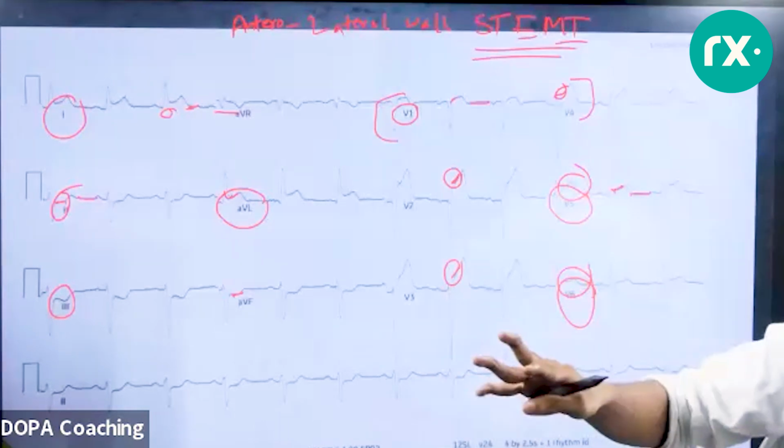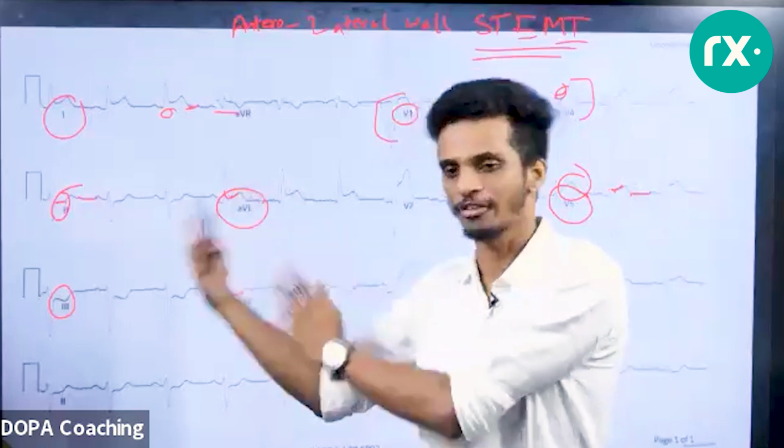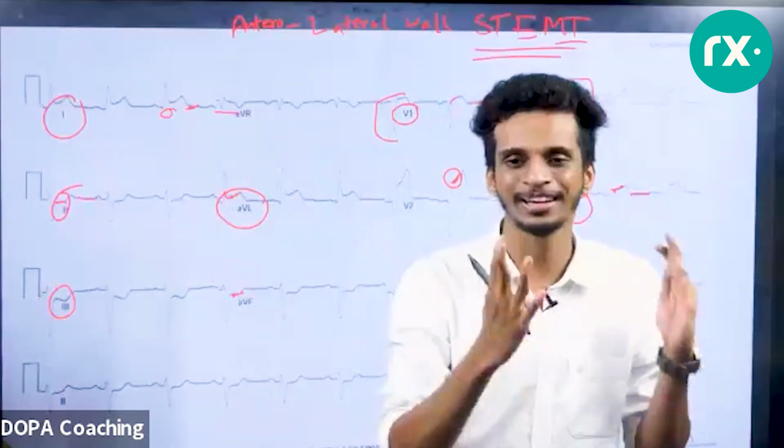I'll discuss, I'll take it out. So what about aVR lead? aVR lead, if I start discussing about aVR lead, it's a whole different topic. Okay, so for the time being, I'll restrict it.